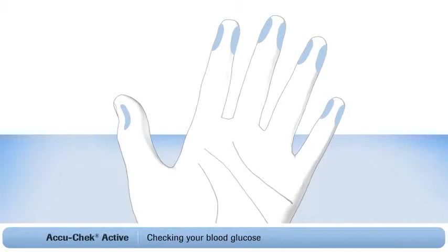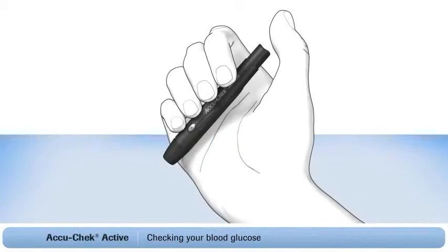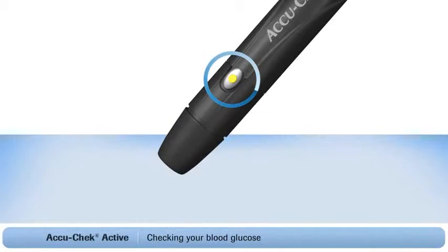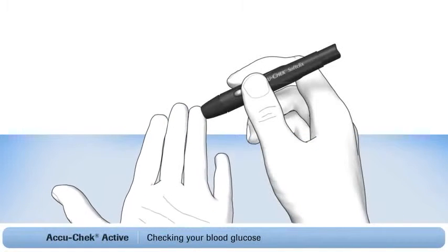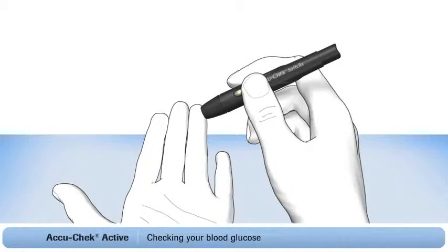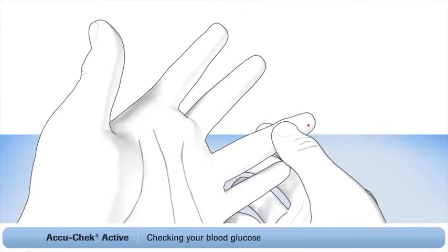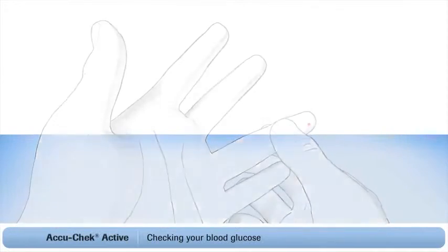Now prime the lancing device. Push the plunger all the way down. The release button on the side of the device has now turned yellow. This indicates that the lancing device is primed and ready to use. Press the pinhole opening on the lancing device cap firmly against the side of your finger and press the yellow release button. Massage the finger in the direction of the fingertip to help the blood drop form.